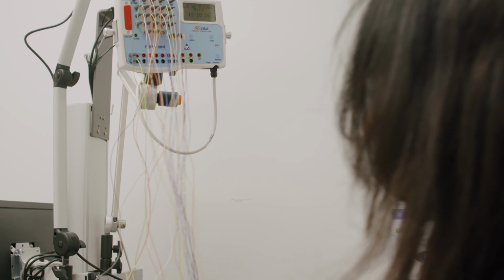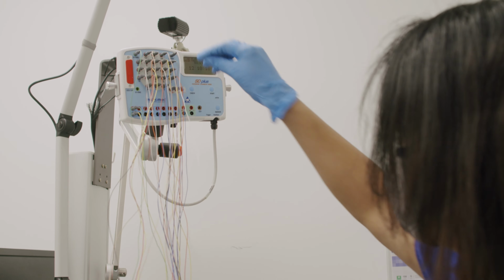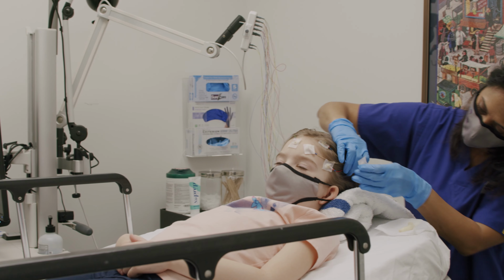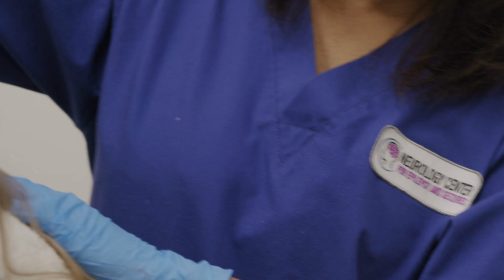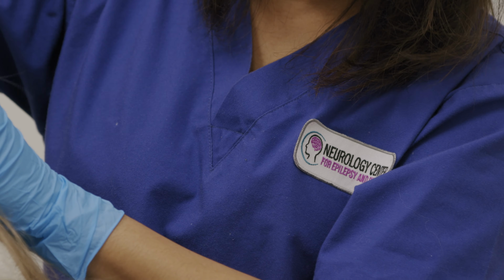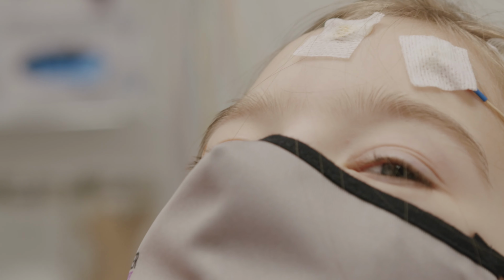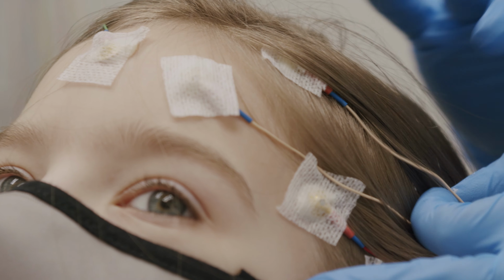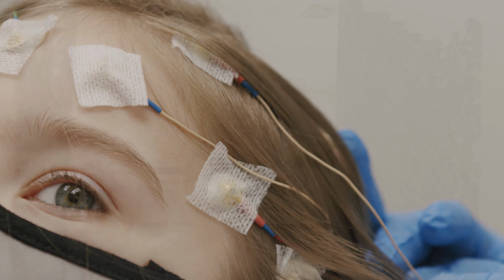An ambulatory EEG is a study where a patient will come in and have the EEG equipment applied to them, and then they take the equipment home for 1 to 3 days, and most often it includes taking home a video camera to possibly capture any spells or symptoms that they may be having.